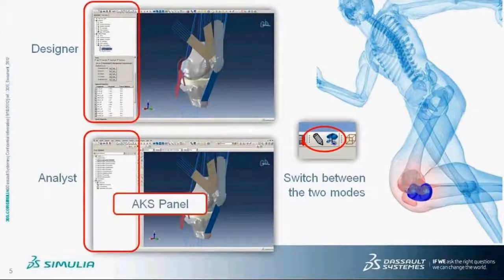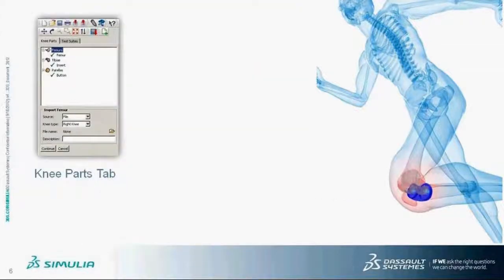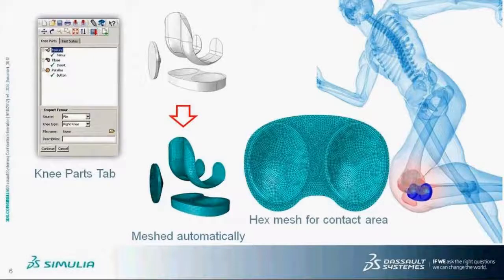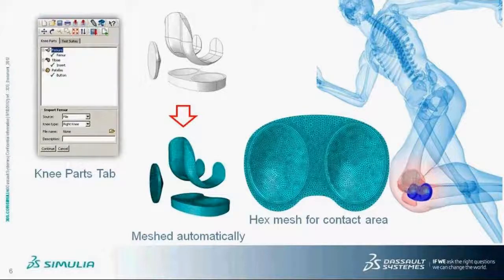For both modes, the Abaqus Knee Simulator functionalities are collected in the AKS panel on the left of the interface. Within the AKS panel there are two tabs. First is the Knee Parts tab, where the knee implant components are imported into the Abaqus Knee Simulator. These components are meshed automatically upon import.